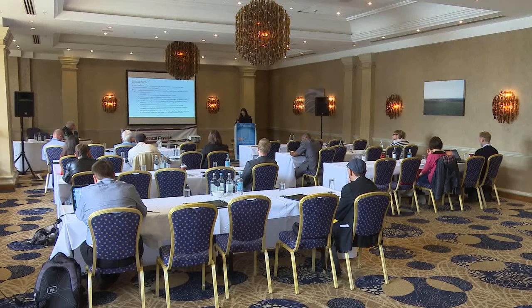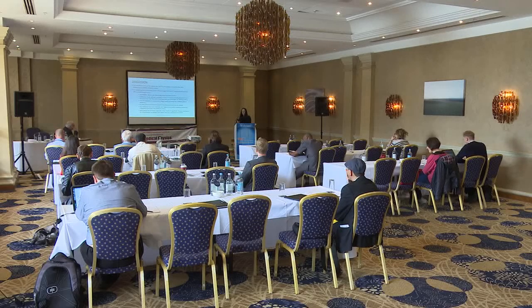For those reasons, it's very important to record routinely and regularly the patient radiation doses and compare them with the reference levels, the local one or the national if they are available. DRLs should be reviewed especially when there is significant change in protocol or in the fluoroscope equipment and where they are consistently exceeded.